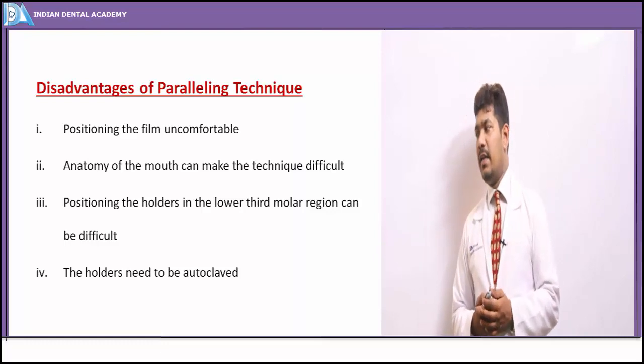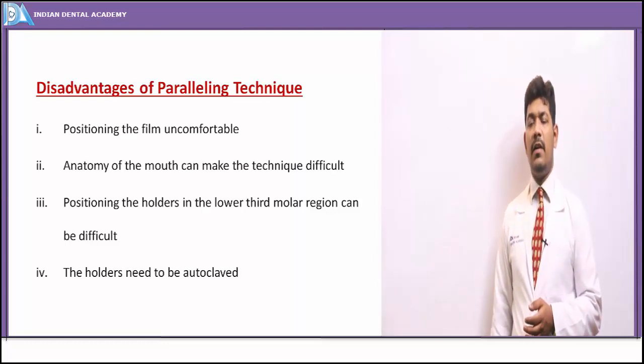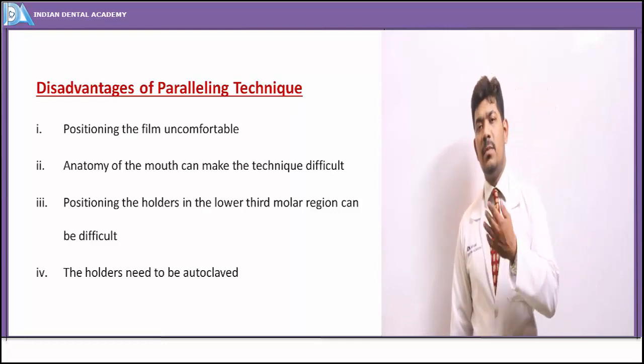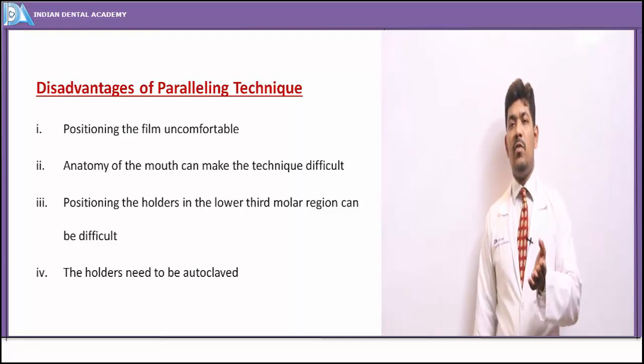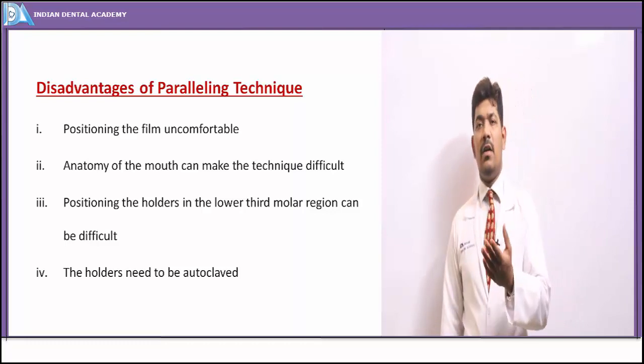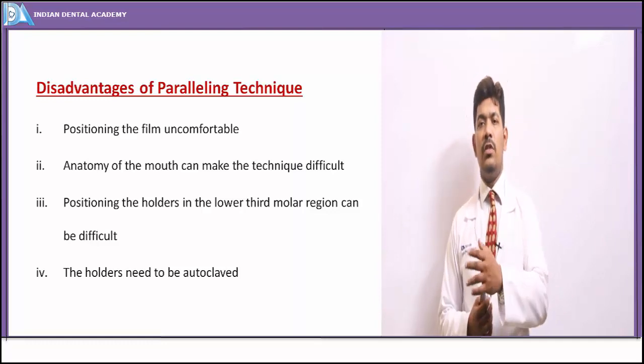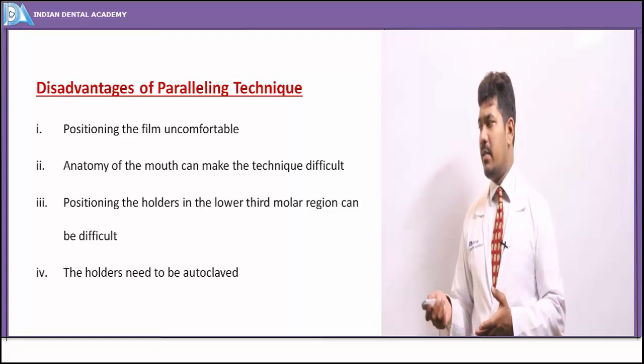Similarly, the difficulty again arises when we are taking the third molar projections. Again, the placement would be much more difficult and impractical. And the holders used for placing the X-ray films have to be autoclaved on a regular basis.